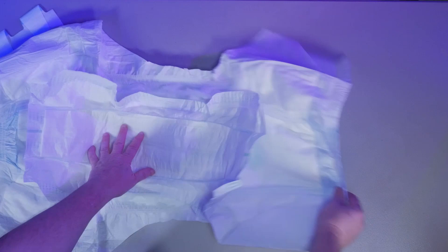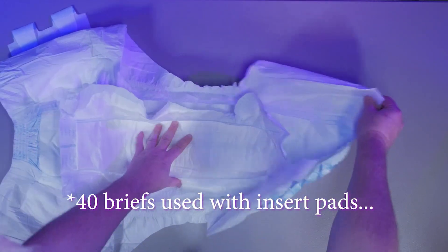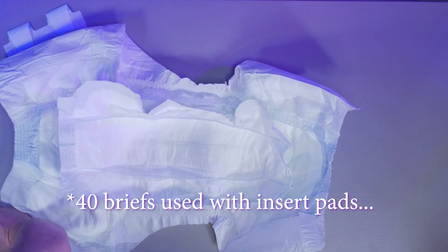One of the major design ideas of this system is the ability to swap out a used pad with a dry one and continue to use the outer brief. However, for this review, with 40 briefs used, only one time was I actually able to reuse the outer brief and simply swap out a used pad.